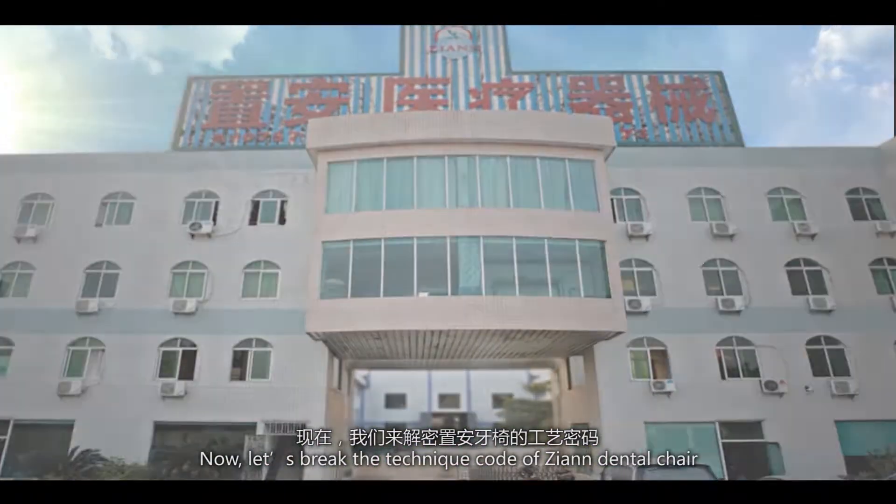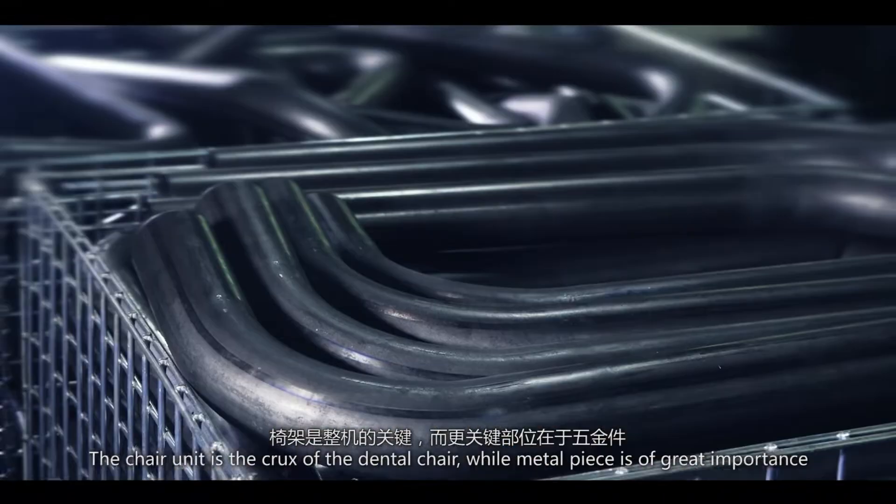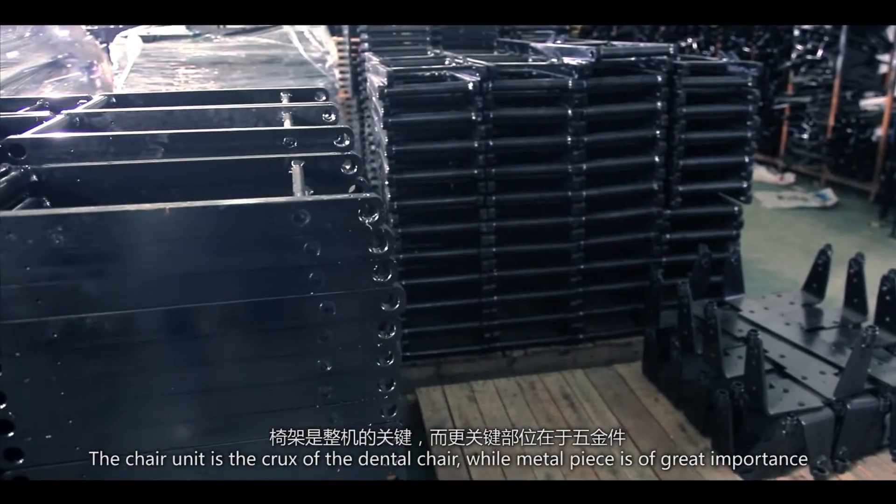Now, let's break the technique code of Zhiyuan Dental Chair. The chair unit is the crux of the dental chair, while the metal piece is of great importance.